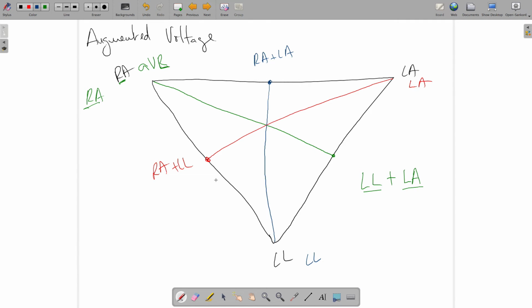So this lead over here is AVF, augmented voltage from the feet, lower leg towards the feet. This guy over here was AVL, augmented voltage, left side. And you'll see now we've created 3 additional leads, and these 3 additional leads are leads AVR, AVL, and AVF. What you'll also notice we've created here is a triangulated new reference point, which is this intersection right here. And that intersection right there is called Wilson's central terminal.